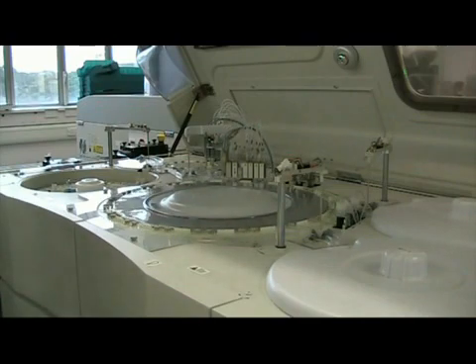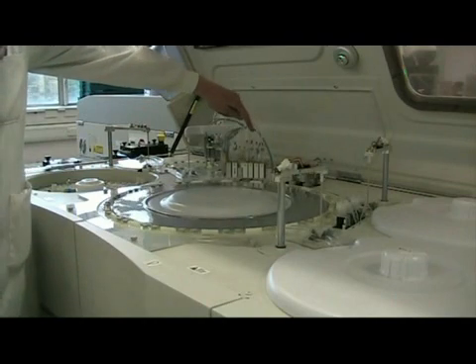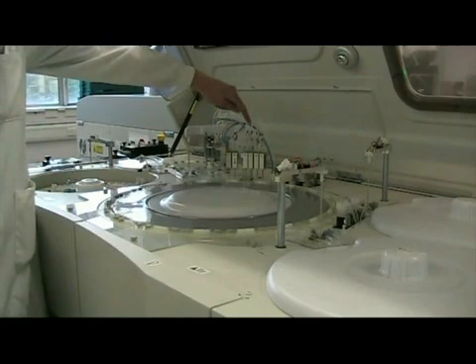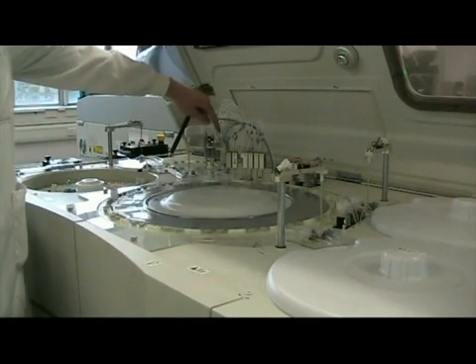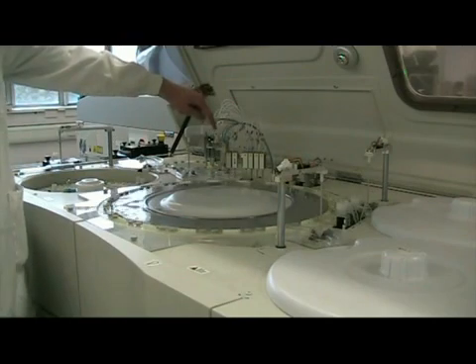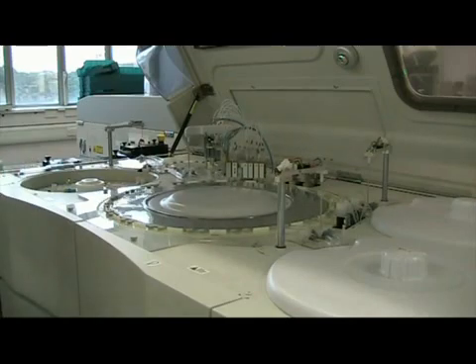After each cuvette is used at the end of its 10 minutes, it's washed very carefully at this wash station — the cuvettes get an acid wash, an alkaline wash, then a water wash, and are vacuumed out so the cuvette is clean and dry before it's used again. It also shines a light through the cuvette to check that it's clean.